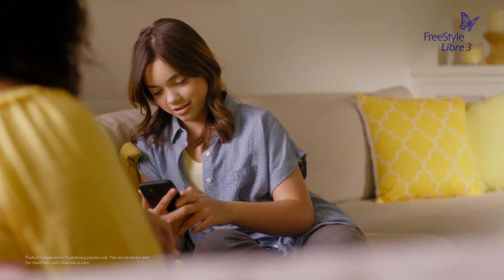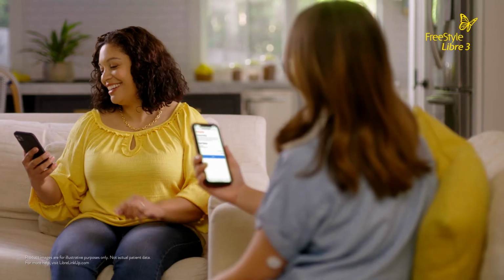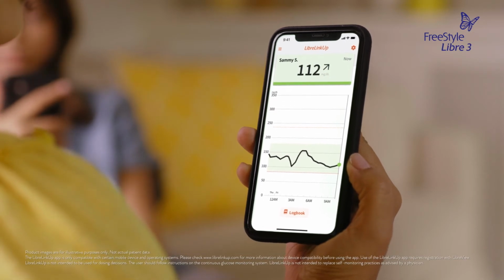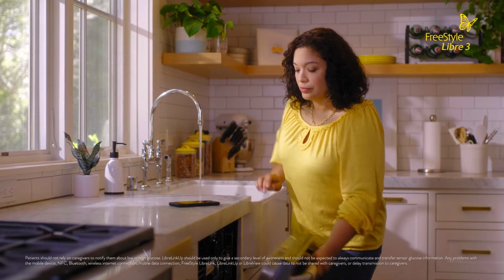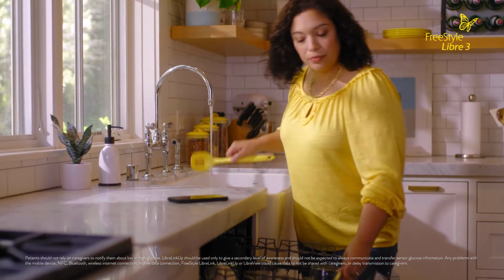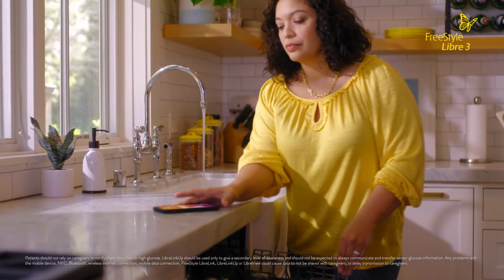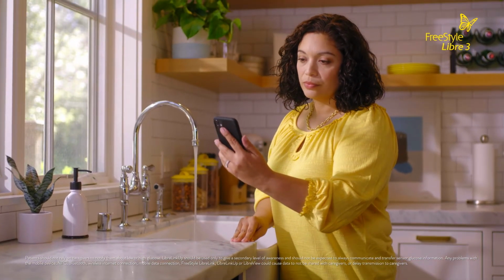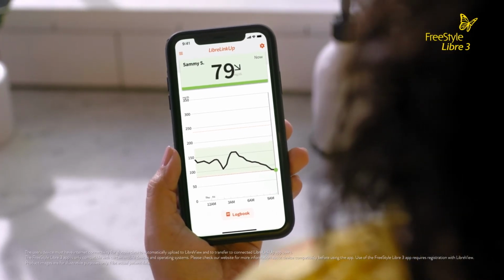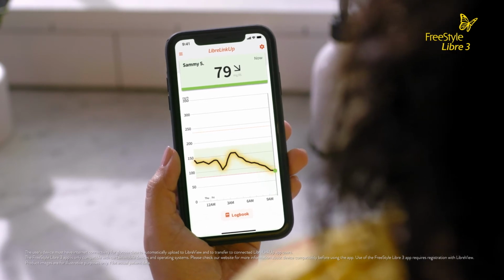After your family members receive an email invitation to connect, tap on the link in the email to download the LibreLinkUp app from the App Store. Then follow the prompts to create an account and connect. You will now receive glucose information in the LibreLinkUp app. You don't need to have the app open to receive notifications, and you can customize your alarm settings from your connection. Glucose information is automatically sent directly to your smartphone every single minute. With LibreLinkUp, I can see my daughter's current glucose, glucose trend arrow, and an interactive 12-hour glucose graph from the home screen.